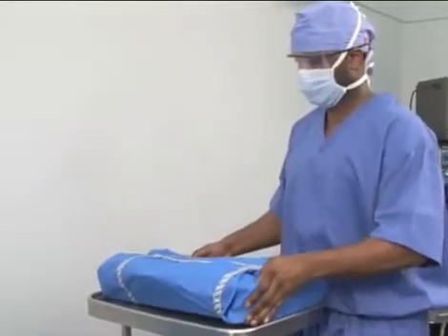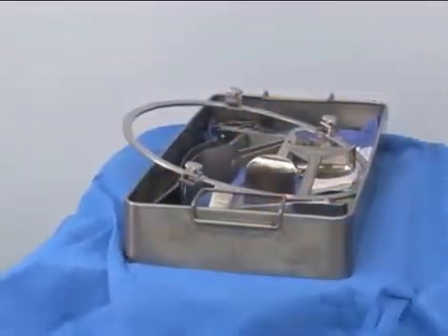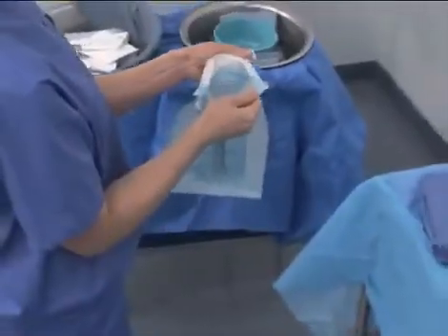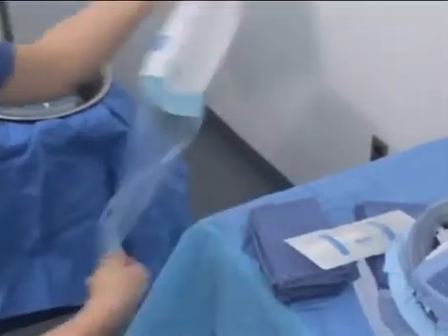Anticipate the need for smaller tables for supplementary instrument trays, drills, and orthopedic components as needed. Small items are opened by removing the outer wrapper. The item is then gently placed onto the sterile table.